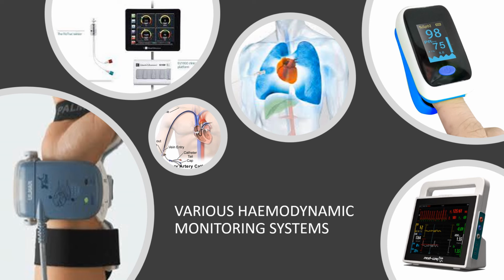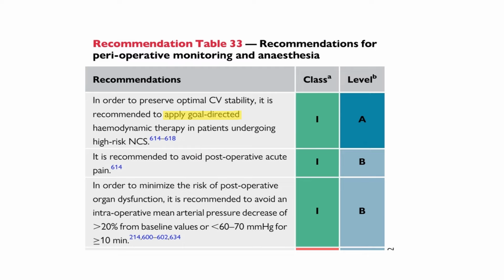And there are various hemodynamic monitors. What I discussed with you was the MostCare monitor or the FloTrac monitor by Edwards. But even your pulse oximetry, which is not invasive, is also a hemodynamic monitor. What it can tell you is the pulse pressure variation. And the age-old pulmonary artery catheter is also there, but obviously it is going out of practice with the upcoming advancement in minimally invasive hemodynamic cardiac output monitors.